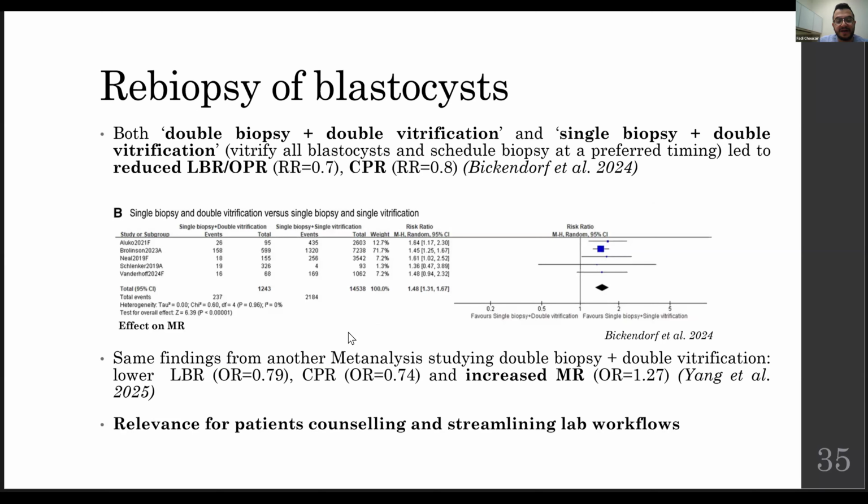And there's another approach, which is the single biopsy, double vitrification, where in some labs they vitrify all blastocysts and schedule the biopsy at a preferred time, and there they do a single biopsy. Both approaches led to reduced live birth rate, ongoing pregnancy rate, and clinical pregnancy rate.